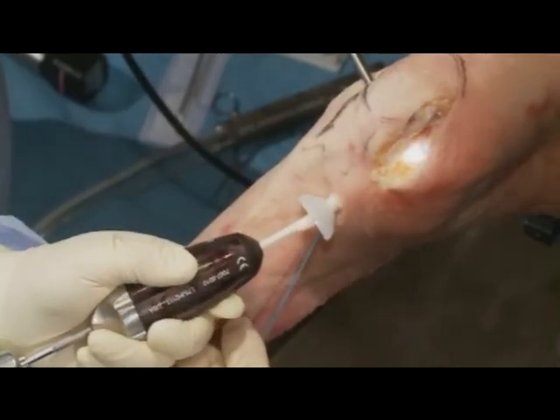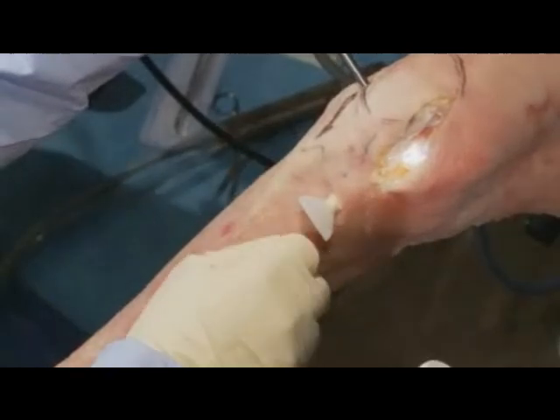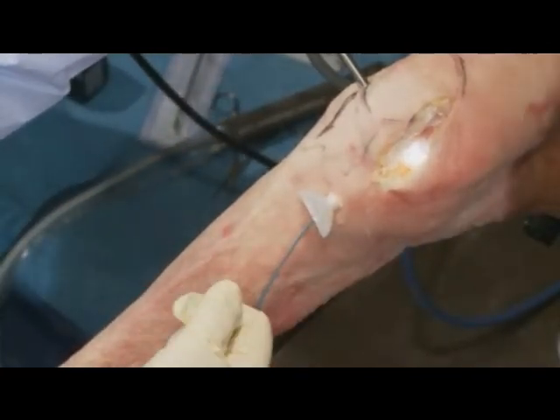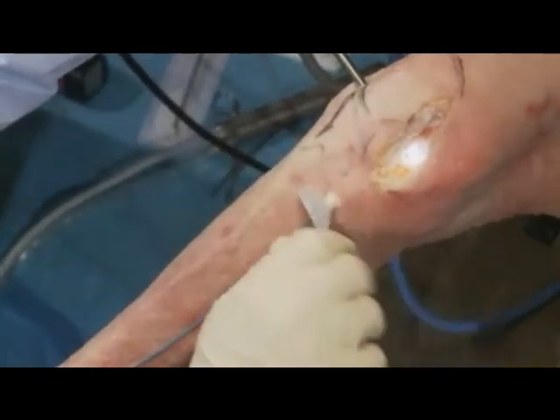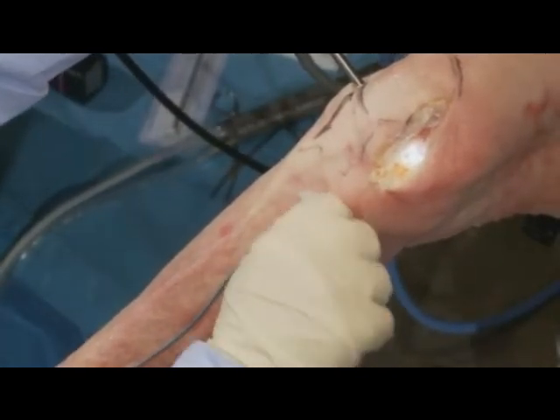And you can see the cement starts to extrude itself out the hole. And if you look inside the joint. So what I do is it's sort of a three-step technique. I put some in, hold the cap down, and then I put a little more in to allow the cap to come up, and I pull it down again, and then I put a little bit more cement in, just let it sit for a while, and then I just basically take this plastic device out of here.